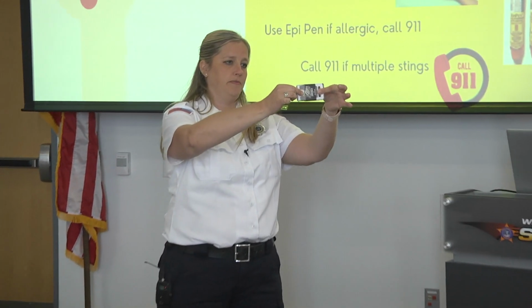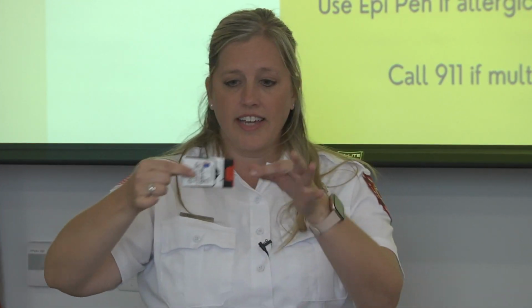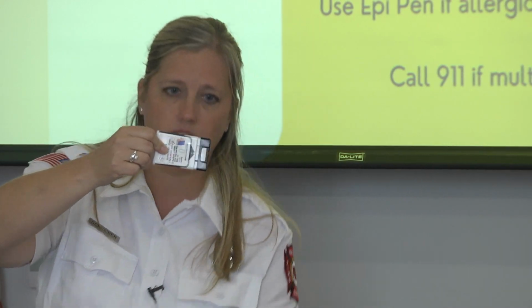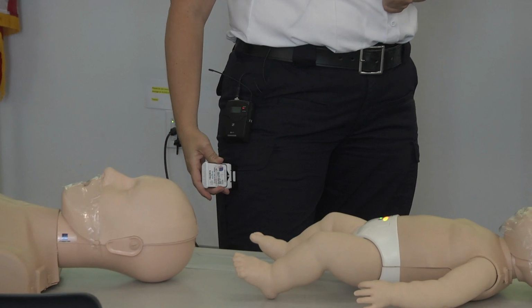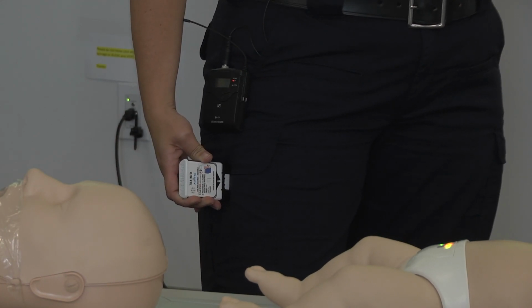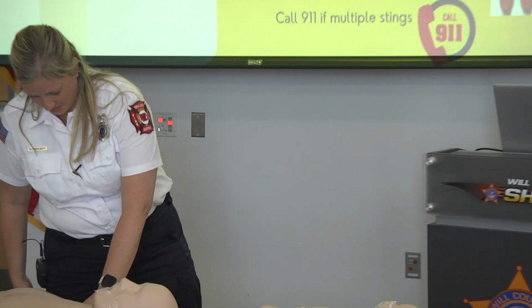And this one pulls out. This one tucks. This trainer contains no needle. And just like the other one had a little safety thing, this one does here too. So I pull the red off. Place black end against outer thigh. So here I'm placing it again against my outer thigh for 5 seconds. 5, 4, 3, 2, 1. Injection complete. And complete. I've done that a time or two.